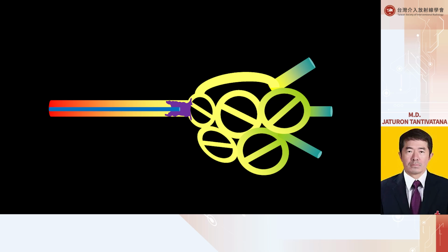We can predict that for the next injection, the Onyx will probably propagate into this portion of the nidus first because it is of a larger caliber and has a low resistance, like this. Maybe a little bit more of the reflux. And then after this, when the Onyx is just reaching the venous side, at this portion the DMSO is dispersed out faster than this portion.